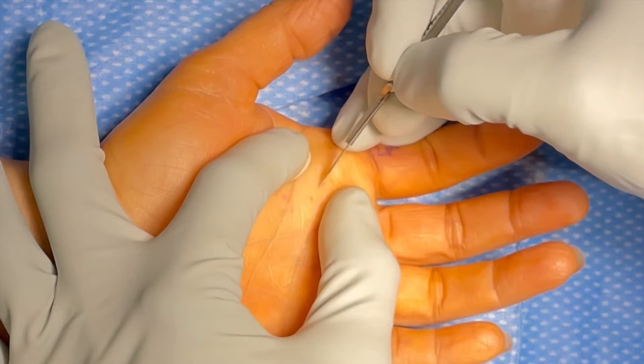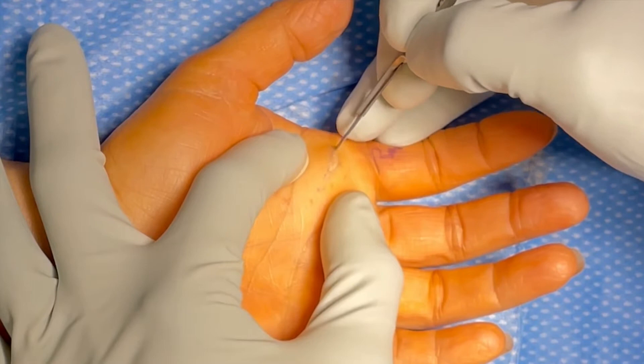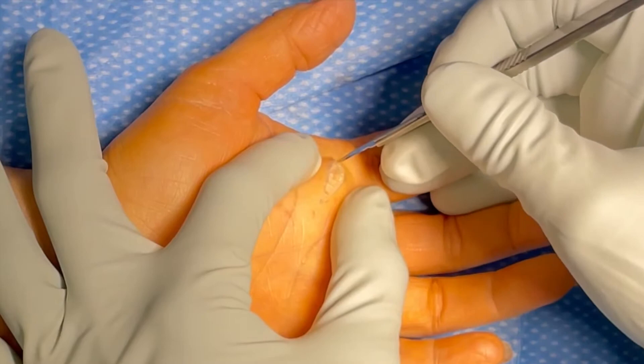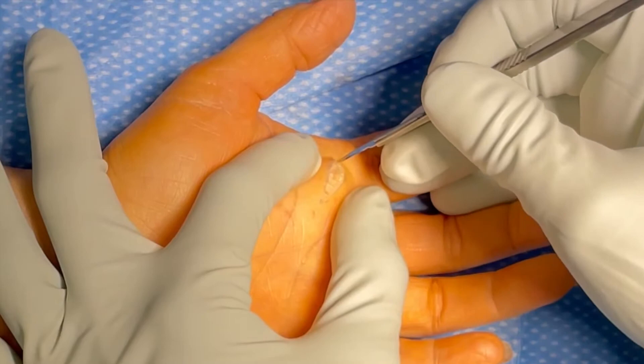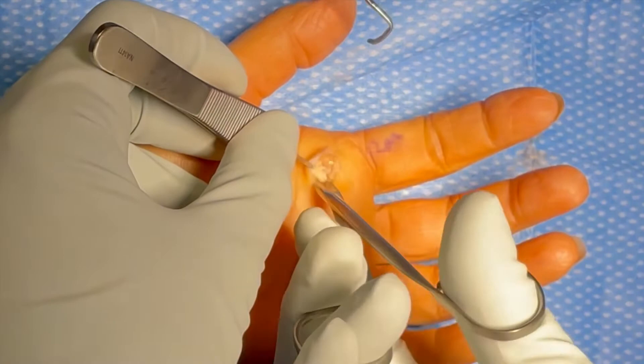You can see here that we're beginning the surgery, using a 15-blade scalpel to make the incision directly over the mass — approximately 1.5 cm in length. We'll then use a tenotomy scissor to bluntly dissect in and around the mass. The mass is going to pooch through the wound here in the next few seconds, and it has a slightly more orange hue to it than the surrounding subcutaneous fat.